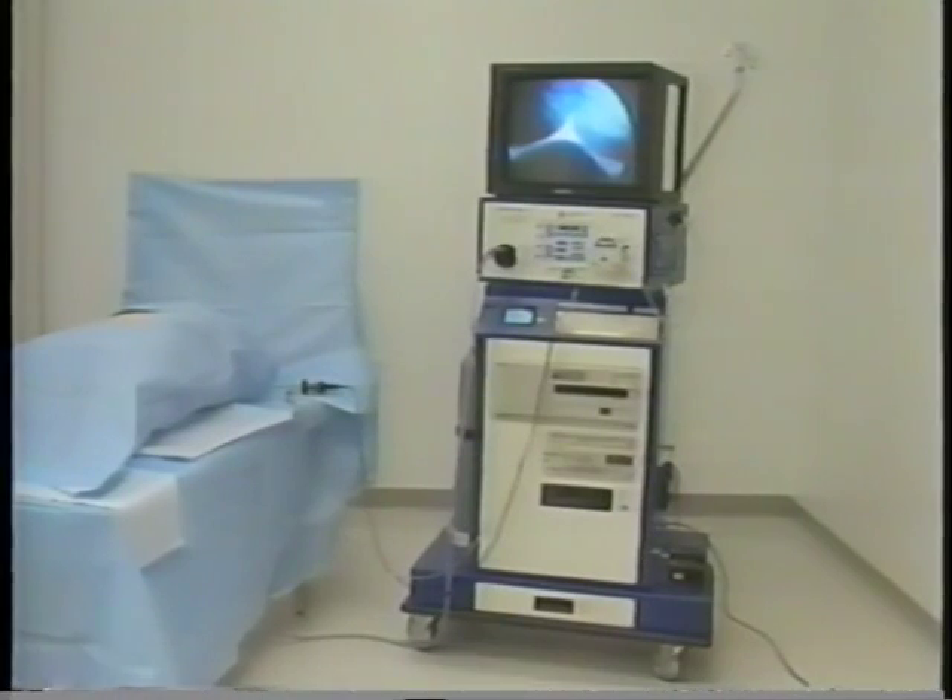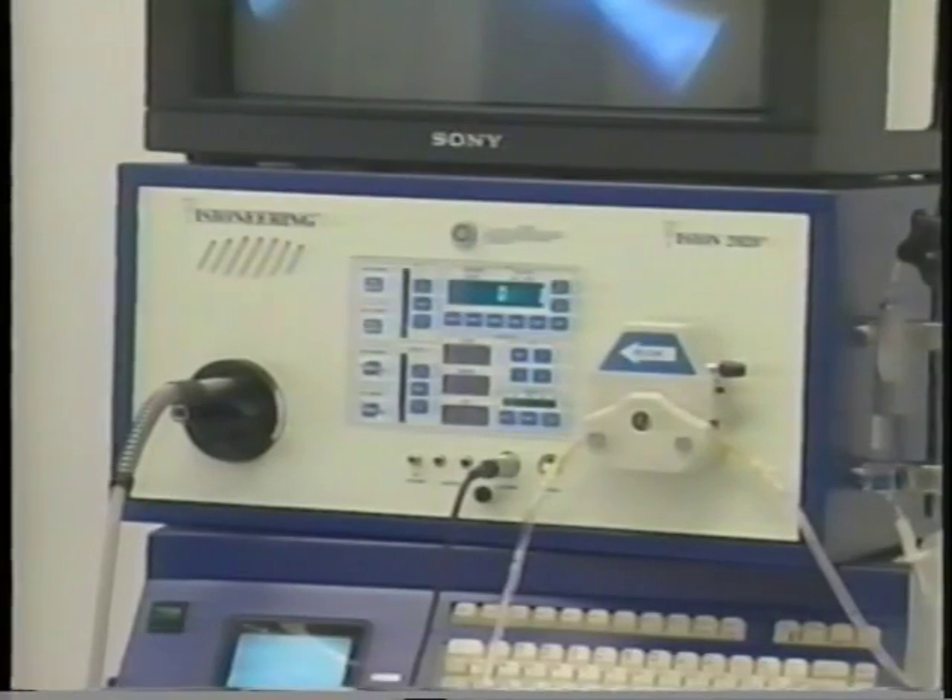This is the revolutionary Vision 2020 integrated endoscopy system. I'm Anthony Nobles, and I'd like to take this opportunity to welcome you onboard Visioneering. I'm going to be demonstrating for you today all the features of the Vision 2020.